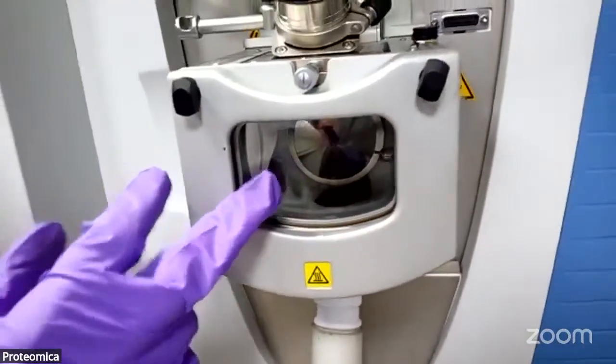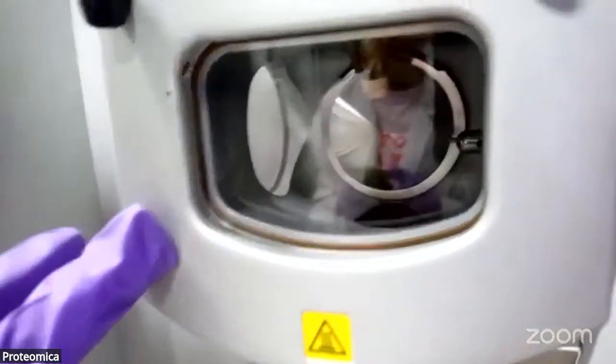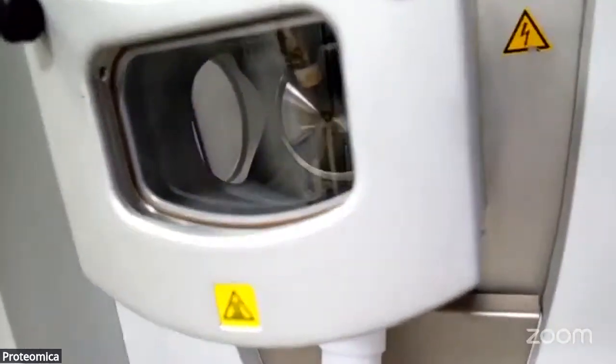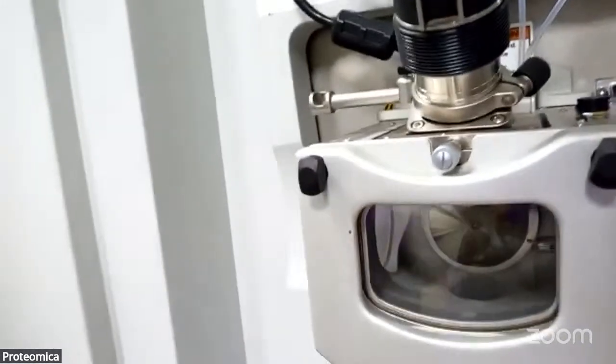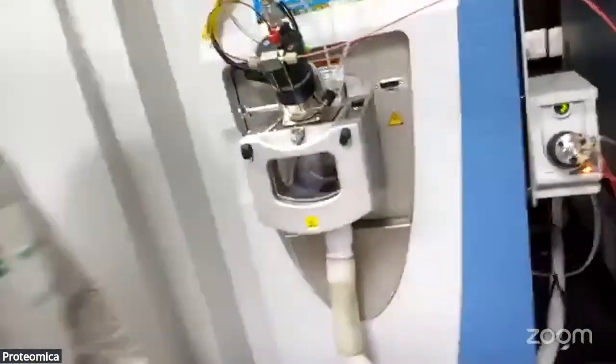So basically there is another component for ITC. Inside there will be a temperature of 320 degrees Celsius, and with that extreme heat the metabolites are going to get fragmented, and then they will go to the subsequent mass analyzers, the Orbitrap and the quadrupole. Then from there we will retrieve the data and try to analyze it with different types of commercial software.